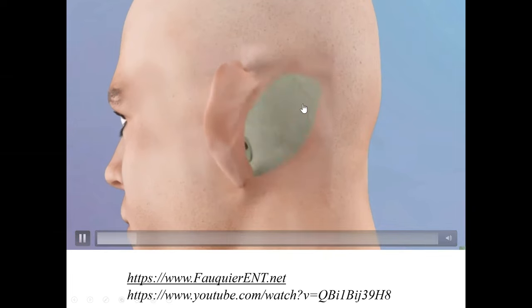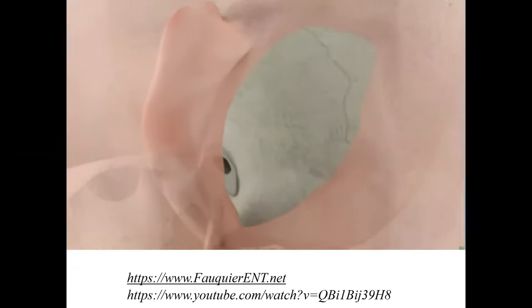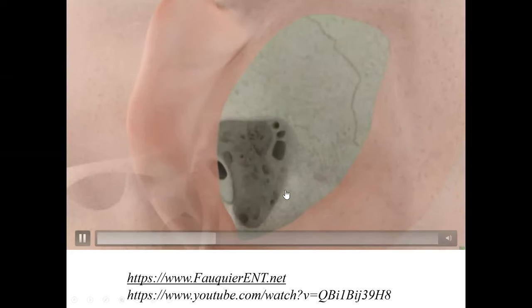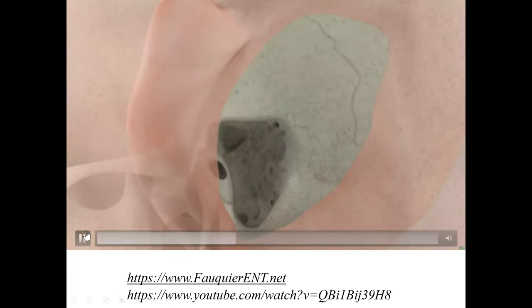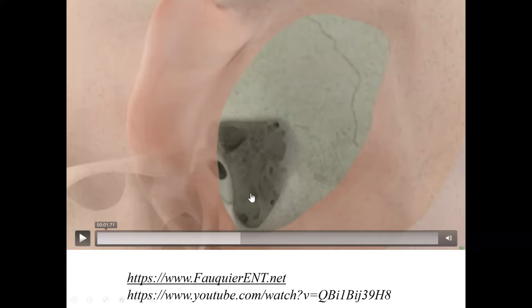After the post-auricular incision, the scalp is peeled back to expose the underlying bone. The surgeons then start drilling into the mastoid air cells, performing a mastoidectomy. This illustrates the mastoidectomy being performed with the various air cells visible. It's really important that when we evaluate this area, we comment on the aeration of the mastoid air cells, which we'll discuss when we review what to include in our report.